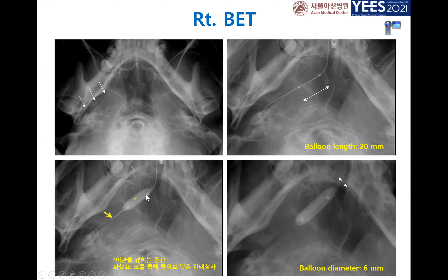We injected contrast media mixed with water into the balloon, so we could clearly see how large the balloon was and where it was being dilated.